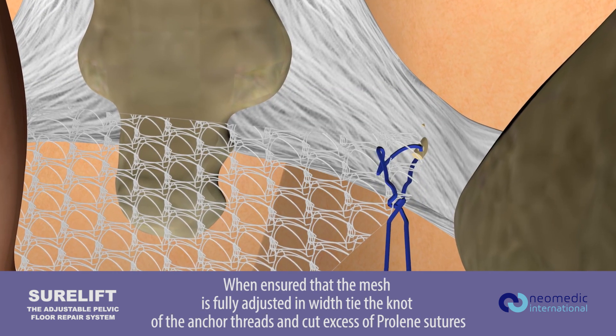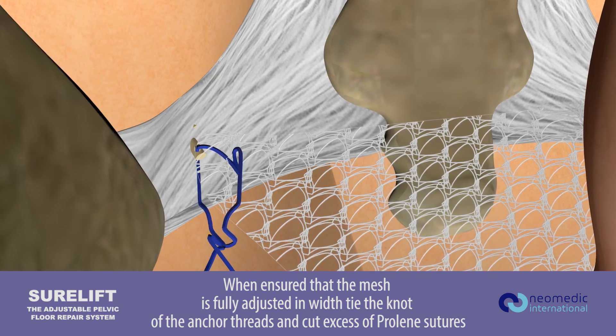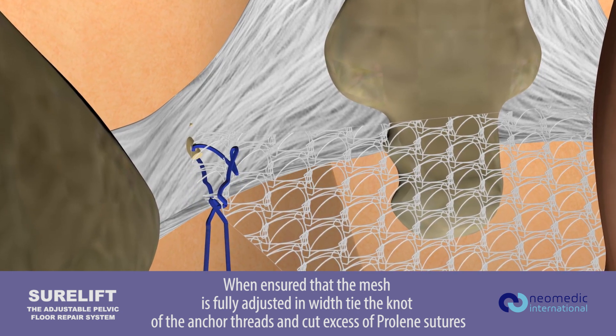When ensured that the mesh is fully adjusted to width, tie the knot of the anchor threads and cut excess of prolene sutures.